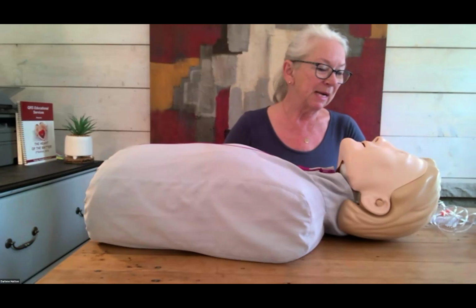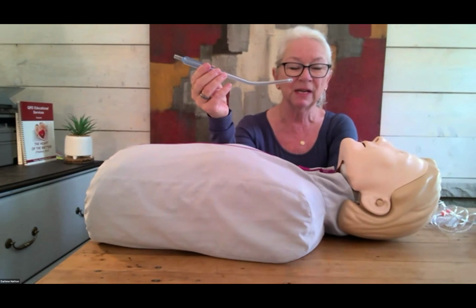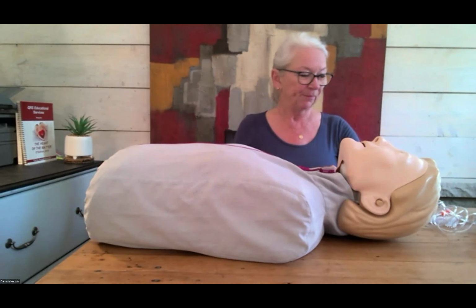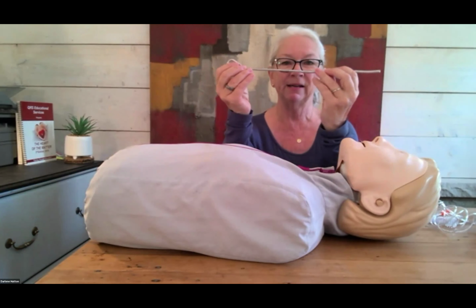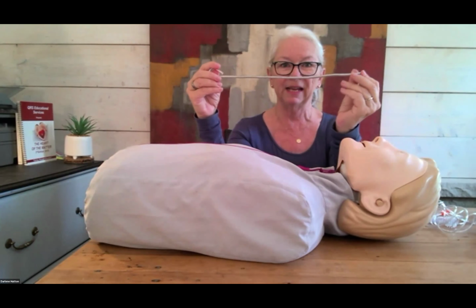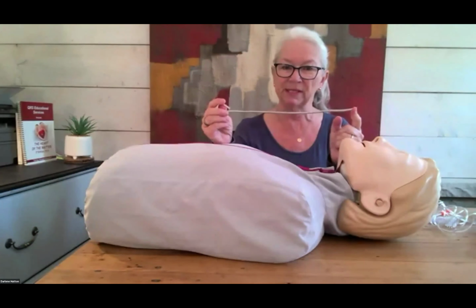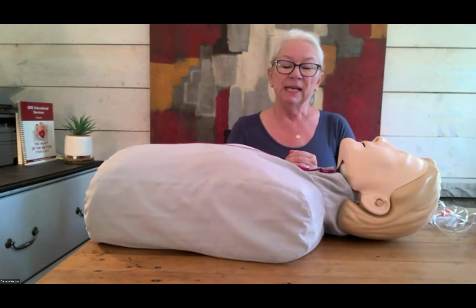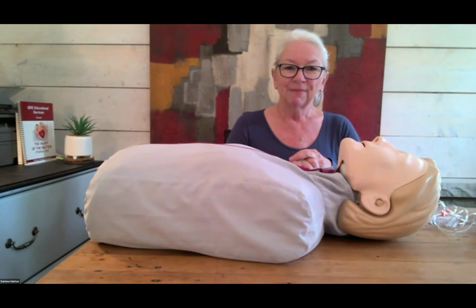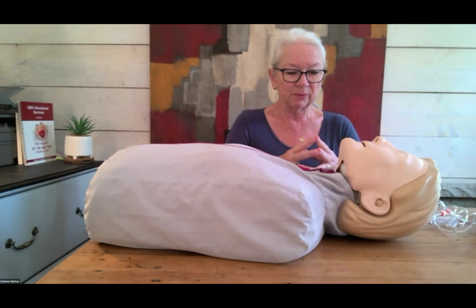So the first S reminds us to get suction, and this needs to be attached to your suction canister. A lot of times patients will need to be suctioned as they are being intubated. Next is the stylet. Take it out of the wrapper, have it prepared. It's going to be curved on one end, straight on the other. Talk about what to do with that if it's required. You don't always get asked to put a stylet into the endotracheal tube. You need your stethoscope. You need your sedation. And for cardiac arrest, sedation is not required.